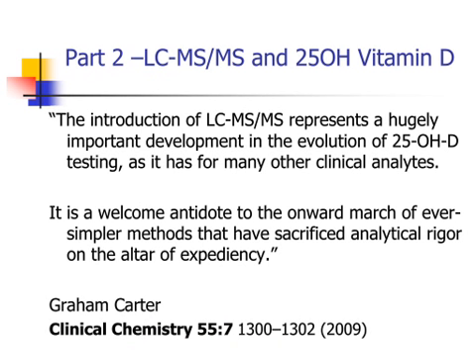And I've put a quote here by Graham Carter, who runs the DEQAS scheme. I particularly like the second paragraph, where Graham says that LCMS is a welcome antidote to the onward march of ever simpler methods that have sacrificed analytical rigor on the altar of expediency. That's quite impressive. I think Graham may have missed his calling in life if he's going to write things like that for clinical journals. But I think we know where he's coming from.